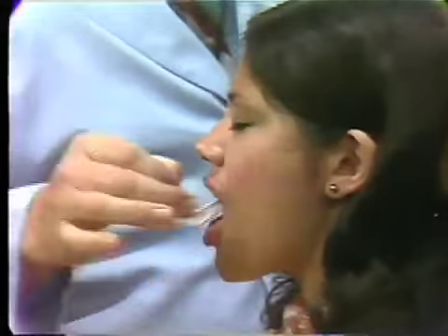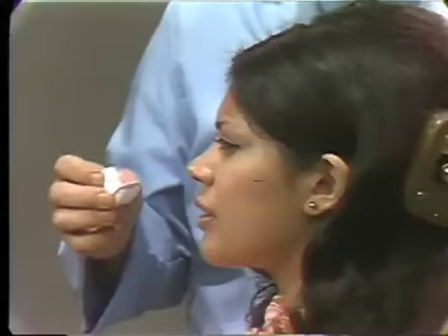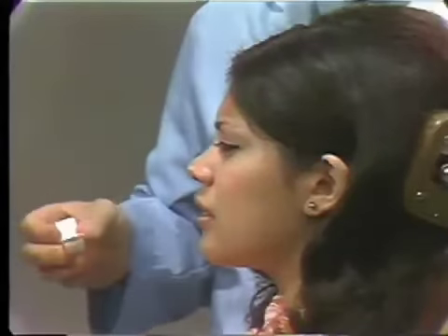Then the next step is to make the exposure, but before we make the exposure, we ask her to close her lips over the teeth. And now we will make the exposure while the lips are closed. Following that, we remove the machine, remove the cone, remove the film and the block, and the first picture is done.